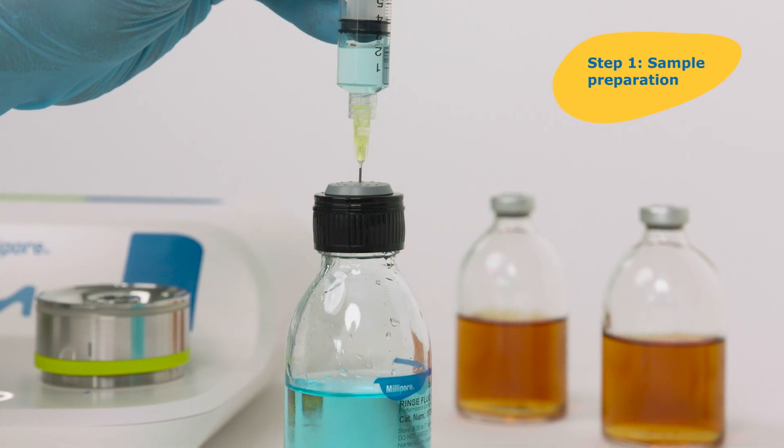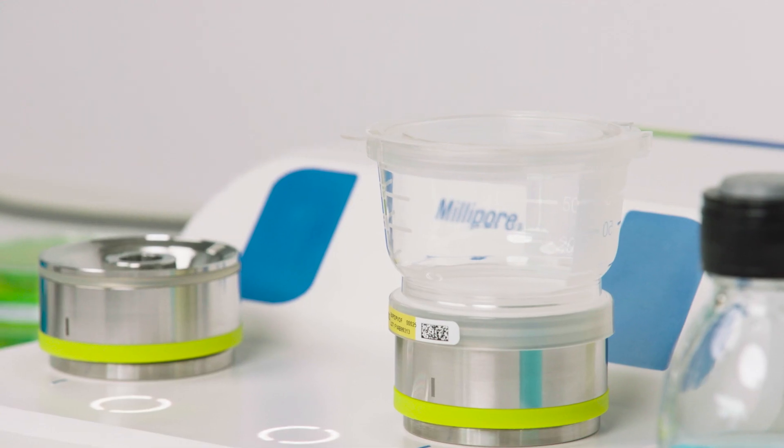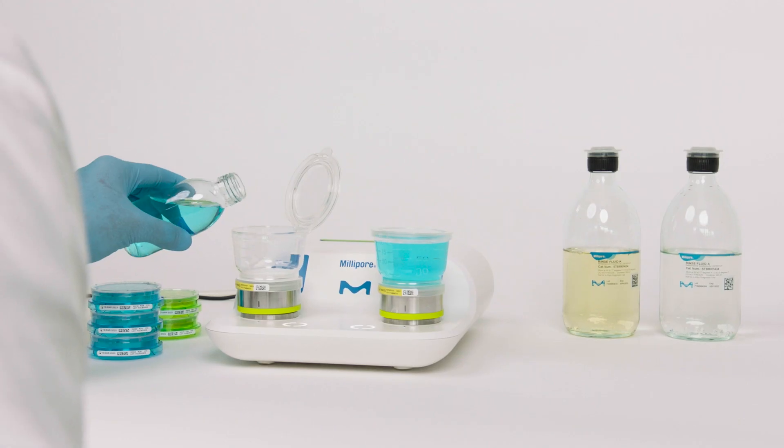Ideal for rapid bio-burden and sterility testing, the system works with many QC samples in the pharmaceutical, beverage and personal care industries.